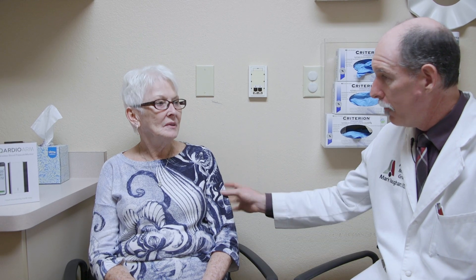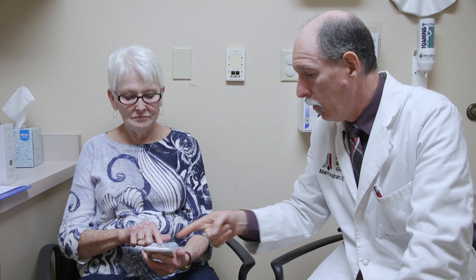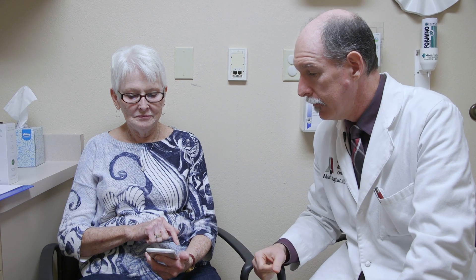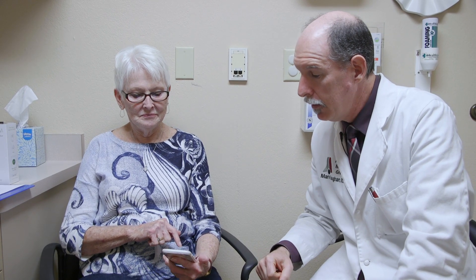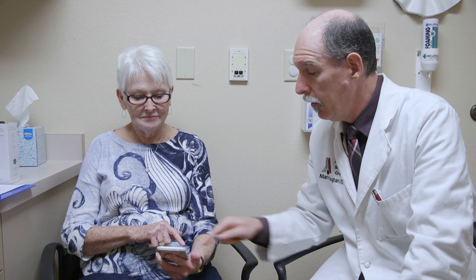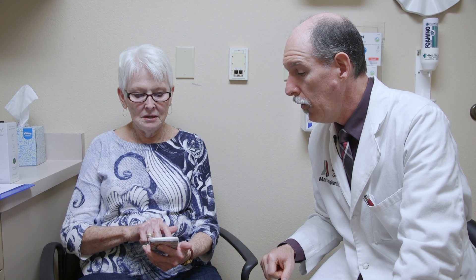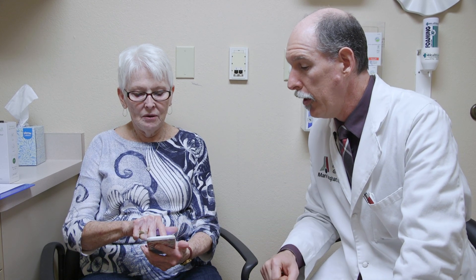So you'd be putting this on your arm and we'll walk through the whole thing with you right now. The first step is to get the app on your phone. Since you have an iPhone, you would go to the App Store. When at the App Store, you would search for — it's spelled Q-A-R-D-I-O. There it is at the top. Just select the Qardio app.